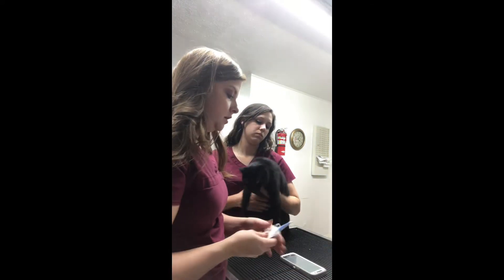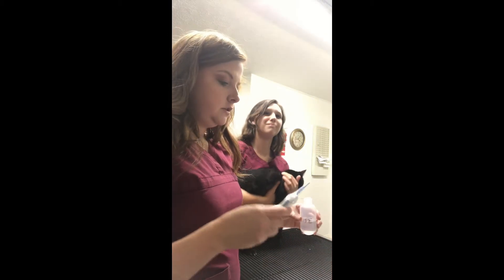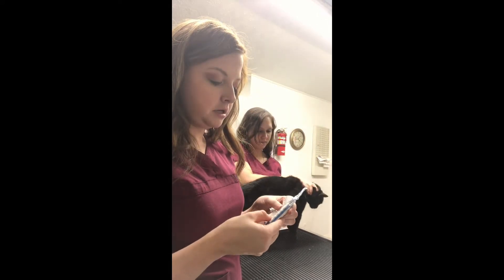Now we're going to get her temperature. We like to do this last because this makes an angry kitty. I'm going to get some lube — I've already placed a cover on the thermometer to keep it clean — I'll turn it on and place it in the rectum.